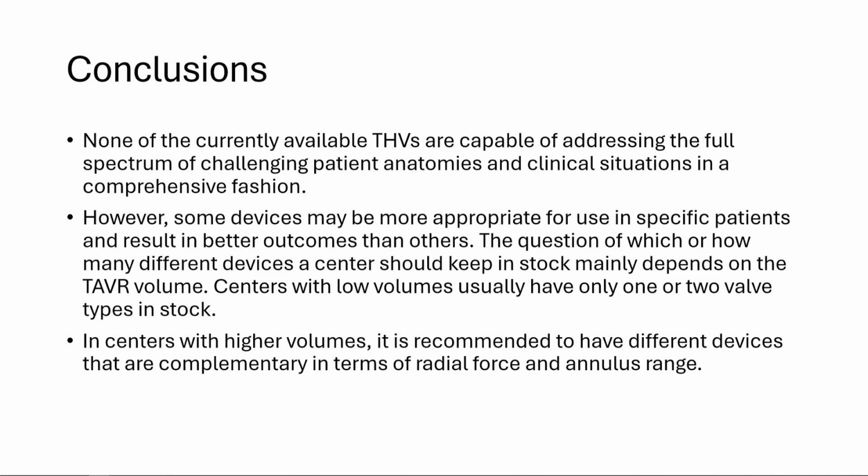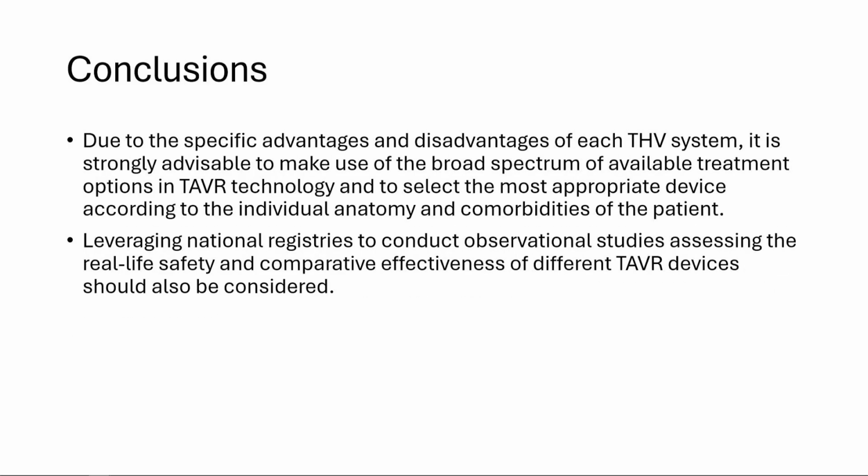However, some devices may be more appropriate for use in specific patients and result in better outcomes than others. The question of which or how many different devices centers should keep in stock mainly depends on the TAVR volume. Centers with low volume usually have only 1 or 2 valve types in stock, and that could be sufficient. In centers with higher volume, it is recommended to have different devices that can offer a larger spectrum.